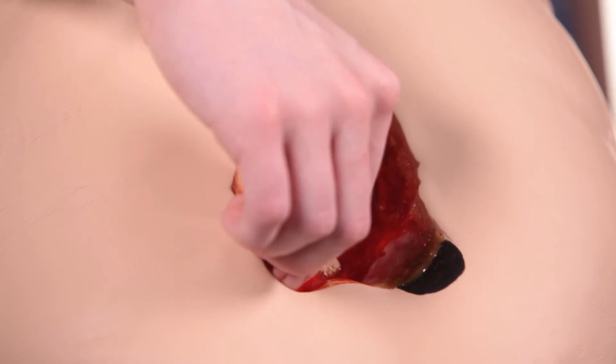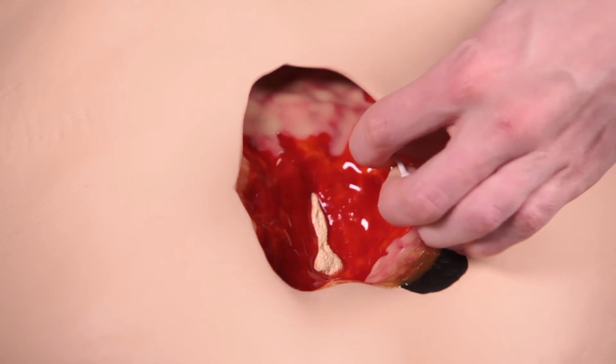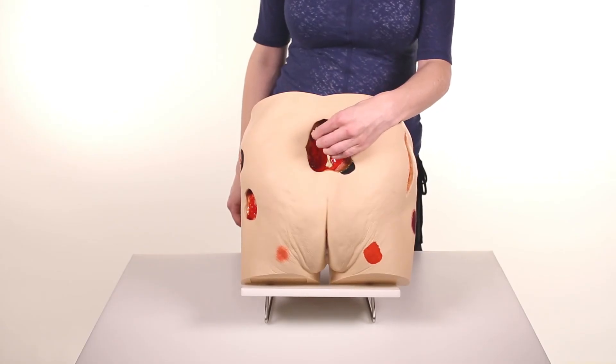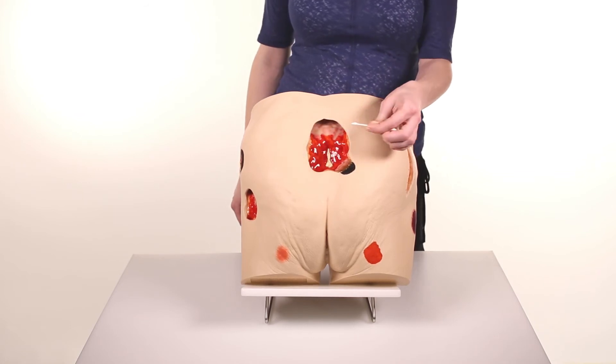Wound assessment has become critical to the operation of health agencies, as inaccurate wound assessment can affect reimbursement, cause inaccurate reporting of patient outcomes, and the appearance of potential adverse events.